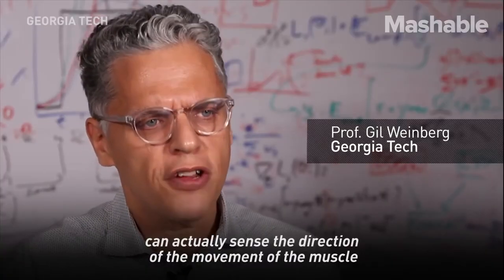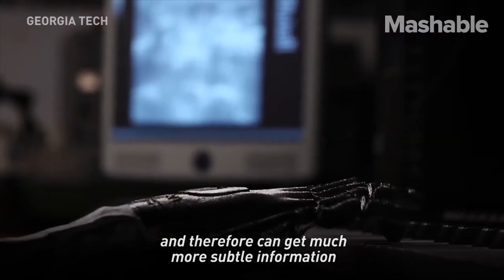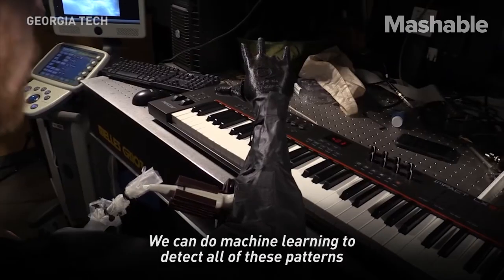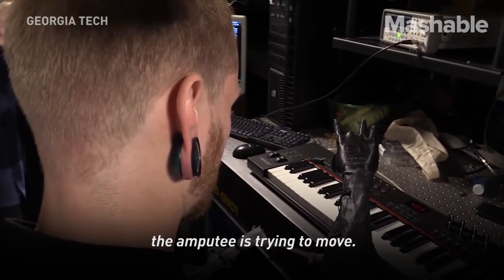Ultrasound can actually sense the direction of the movement of the muscle, and therefore can get much more subtle information from the muscle that relates to finger-by-finger control. We can do machine learning to detect all of these patterns and be able to predict what finger the amputee is trying to move.